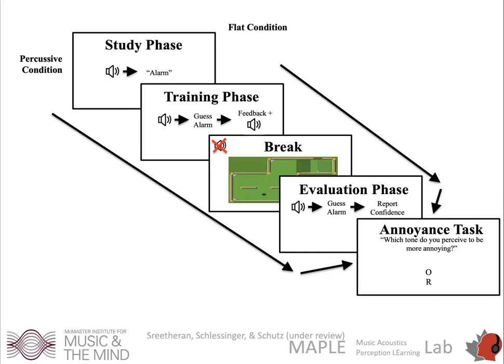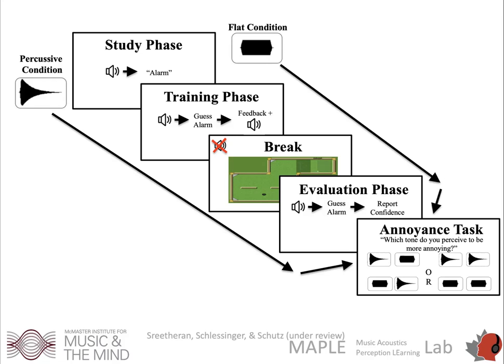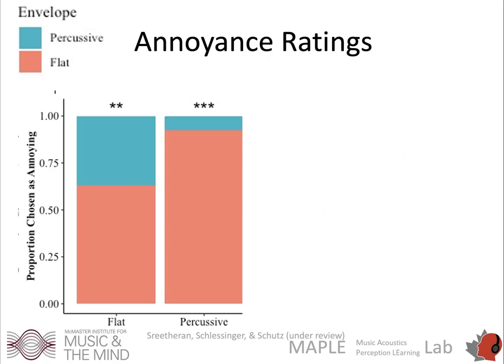Now, there wasn't much difference between the percussive and flat alarms in the evaluation phase for the memory, but what I want to focus on right now is the differences in that annoyance rating at the end, because here we saw some pretty clear distinctions.